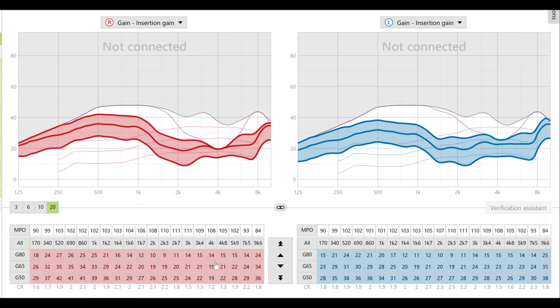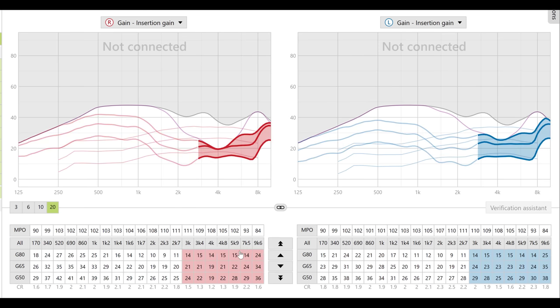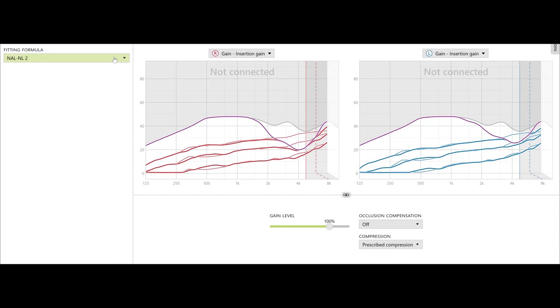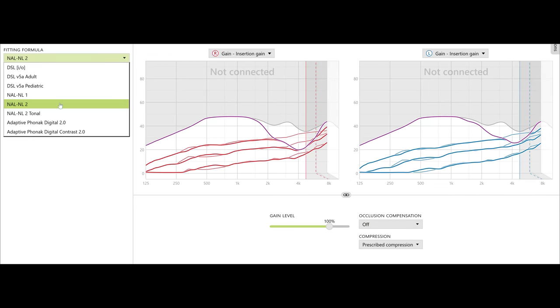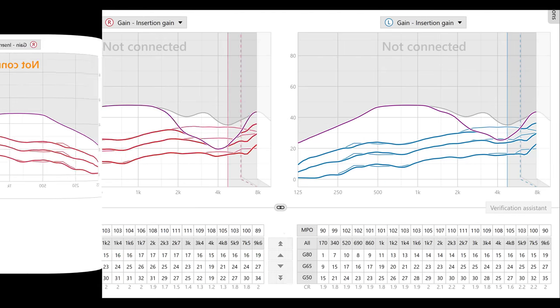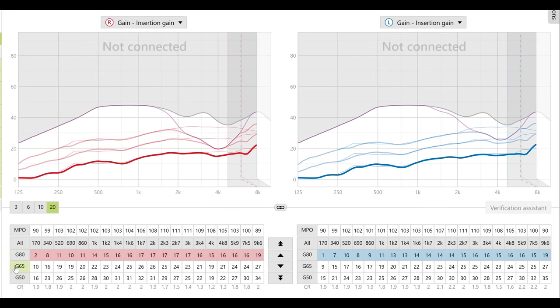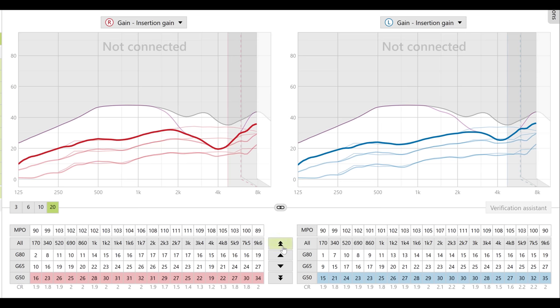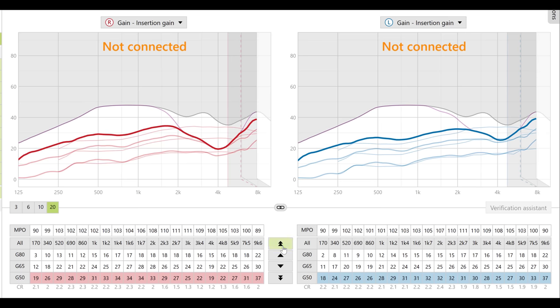If you do not have real ear measurement equipment, it's basically going to be trial and error — adjusting different frequency bands inside the programming software. Keep in mind that high frequencies typically give you more clarity to speech, while low frequencies give you more volume. Each manufacturer's software will give you a first-fit estimate based on the hearing loss you entered. You also need to ensure your compression settings are set up appropriately so you're not over-amplifying loud sounds or under-amplifying soft sounds.